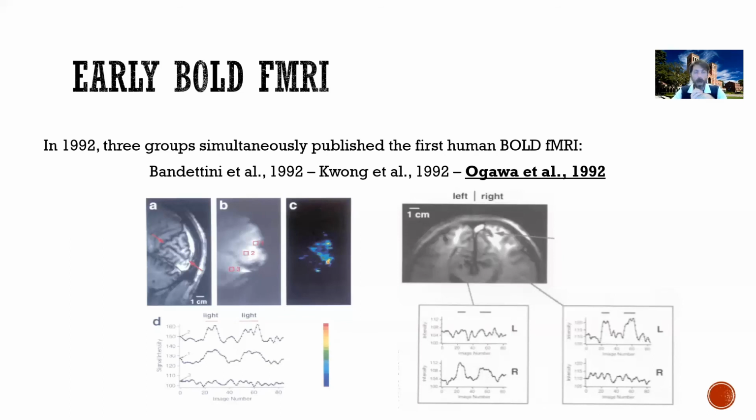So this tells us that at least with respect to different hemispheres, the change in the BOLD signal is not a global change. It's not that the whole brain is changing the strength of its T2 signal. Only parts of the brain that seem to be relevant and important for whatever mental activity or task somebody is doing. So this is very important because it tells us about the spatial precision of MRI, which we'll discuss a little further next time.